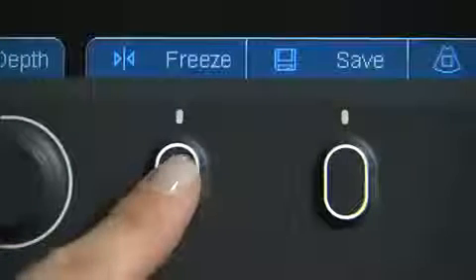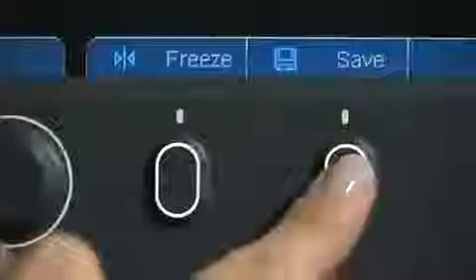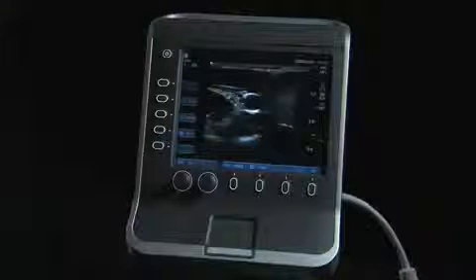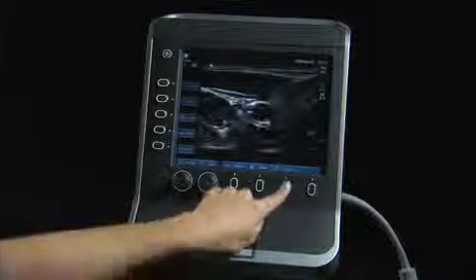The freeze button stops the live imaging and displays a frozen image. The save button allows you to save a frozen image to the internal storage of the system. Color turns color Doppler or color power Doppler on and off.